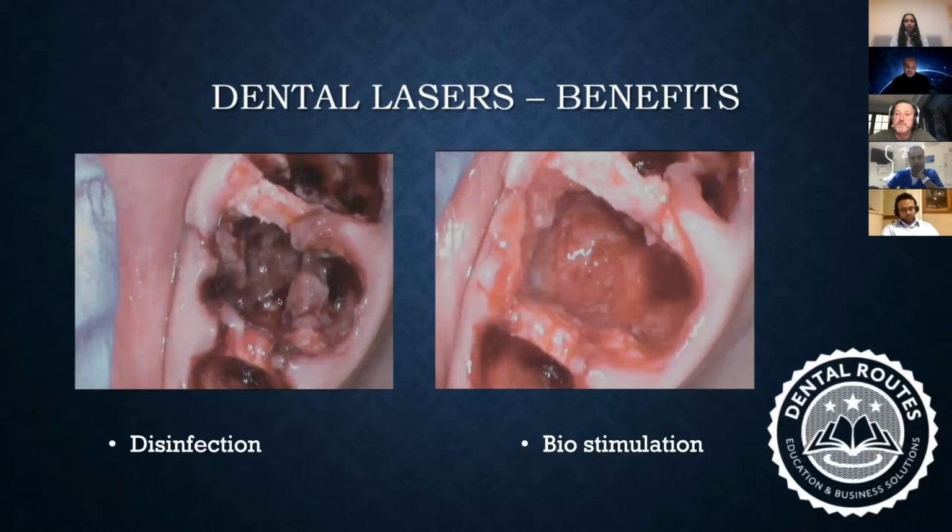Yeah, you just put the tip all over that area wherever there's granulation tissue, and the tip vaporizes it off. You can literally see all the tissue vaporize off, and it penetrates into the creases of the bone without even touching the bone, and completely dries it off. Wow.